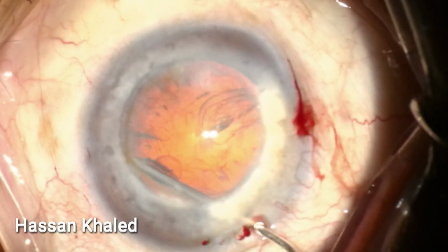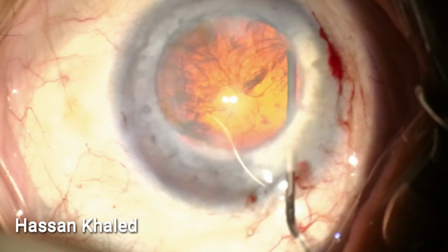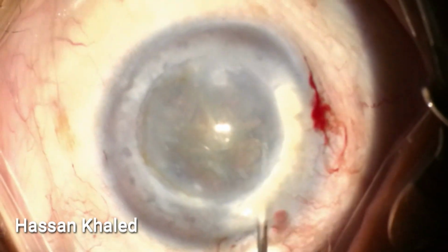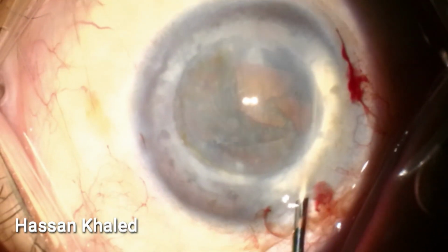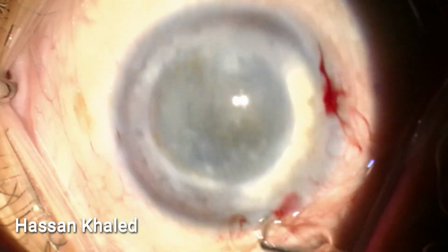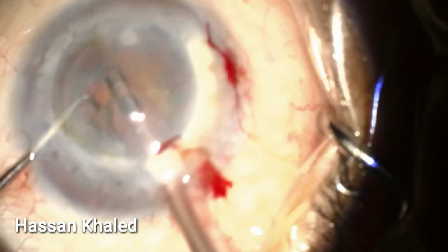Then, before doing the hydrodissection and hydrodelineation, empty the anterior chamber of the viscoelastic slightly. Then, as we can see, using the viscoelastic again for viscodissection of the cortex and the epinucleus, then spin and rotate the nucleus. As we can see, here is the emulsification.